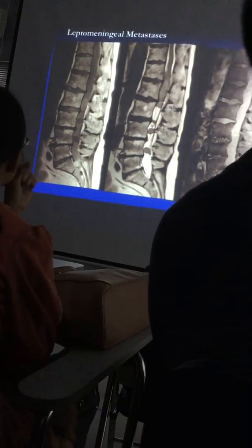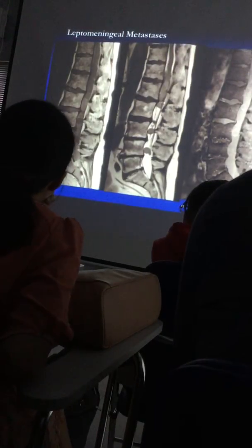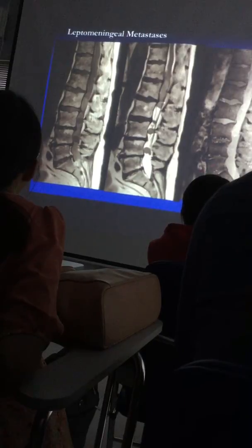Yeah, it's up here. So this is carcinoma of the lung. Carcinoma of the lung, leptomeningeal metastases. There's so many of them, they become conglomerate, confluent.